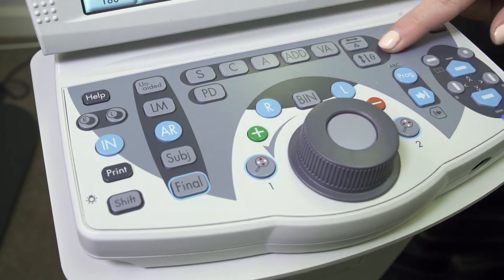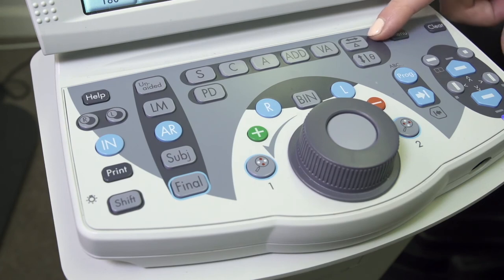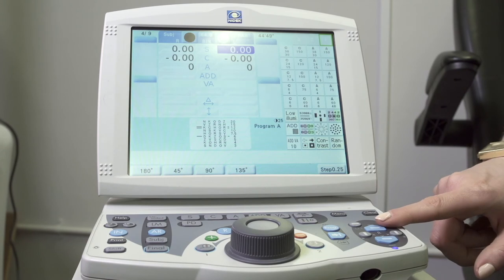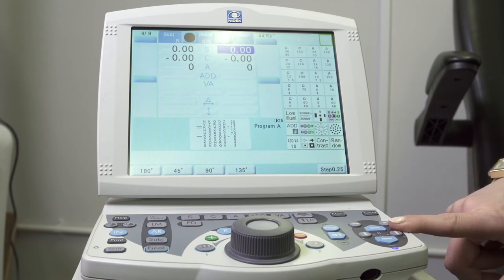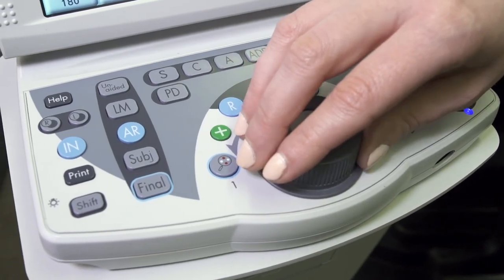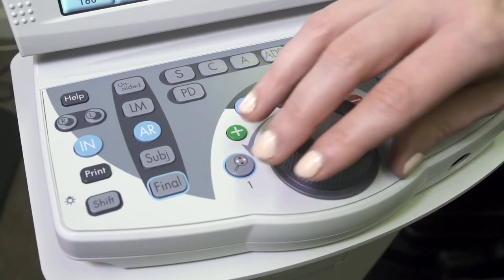On the far side of the panel just here, we're able to use these buttons to mask and isolate different lines and letters. The dial here allows us to wind up and down in 0.25 steps.